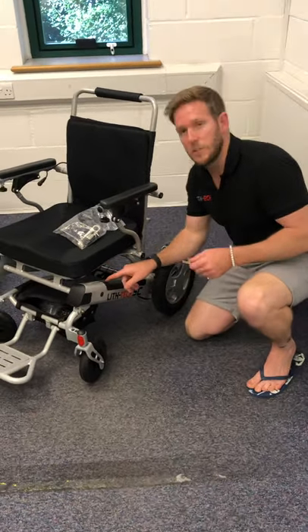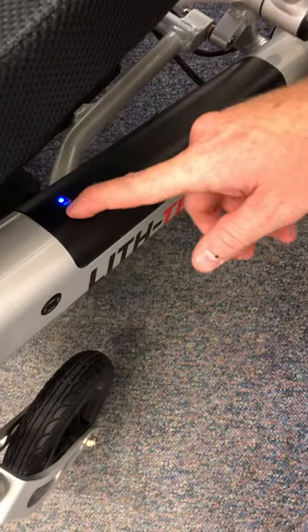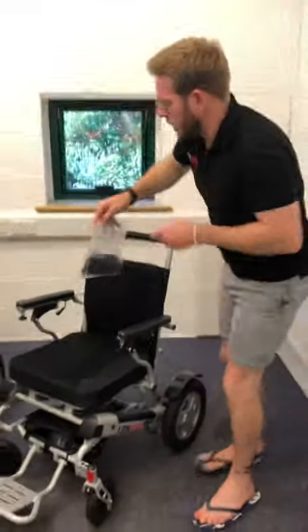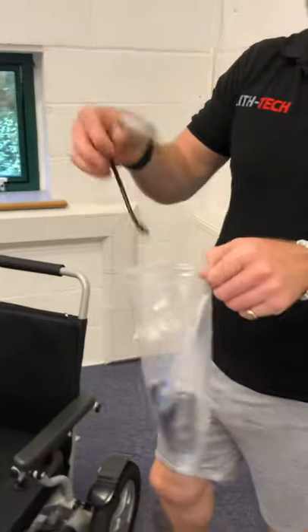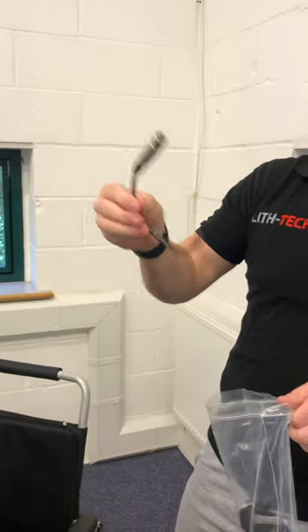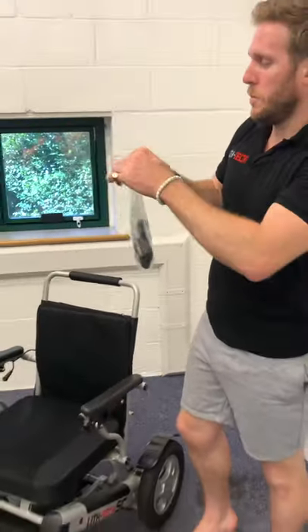There's also a little button at the back of the chair that will tell you how much charge is in the battery itself. What also comes in your little bag is a toolkit, a battery adapter for charging the chair through the batteries, a seat belt, and a spare set of keys for both sides of the batteries.